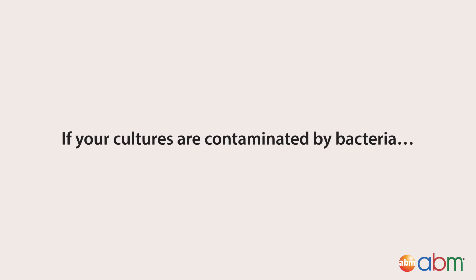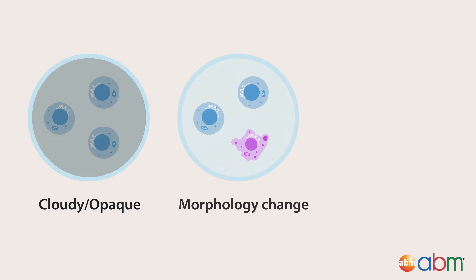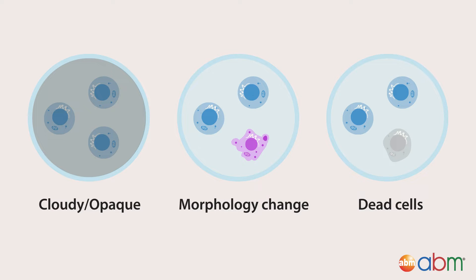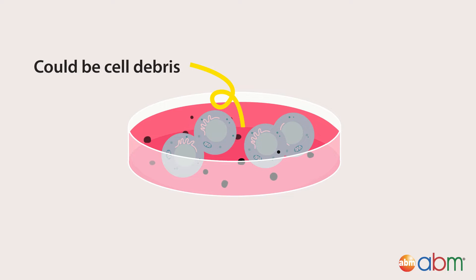If your cultures are contaminated by bacteria, you'll notice a cloudy appearance, cell morphology changes, and the detachment or death of cells. Sometimes, dark spots may appear which can indicate contamination, but it could also just be debris from the cells.